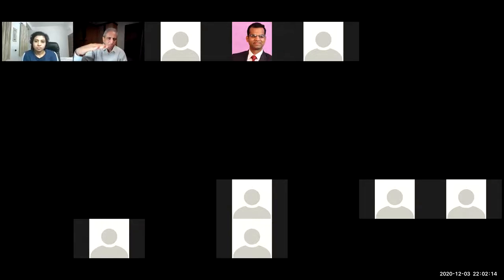If you want to drain something, keep it parallel to the iris and push it down so that the contents of the eye come up. These two, if you remember, it will be very easy. Many of the steps will become very easy if you understand this philosophy. As Dr. Preeti said, if you press it down, content will come outside.